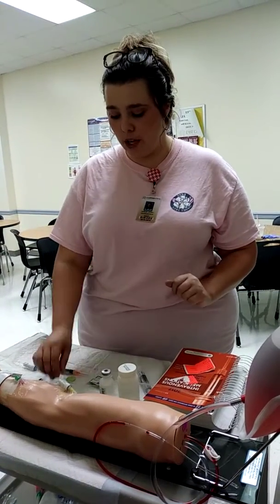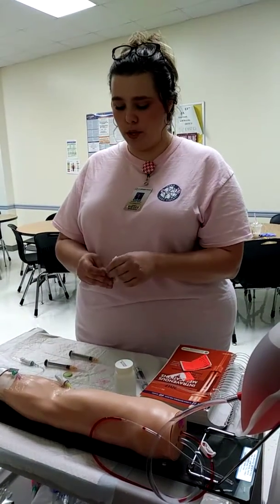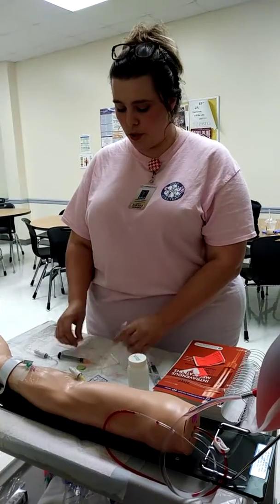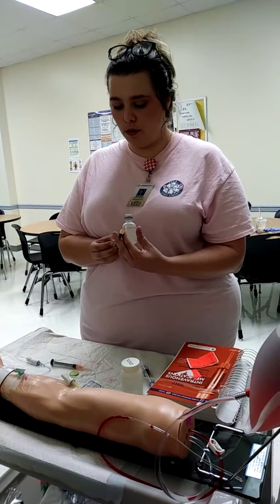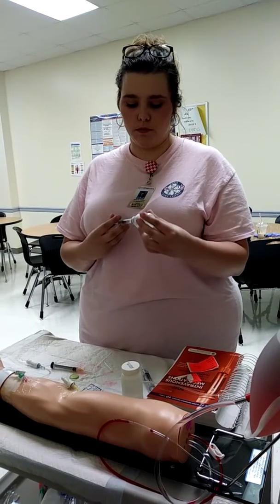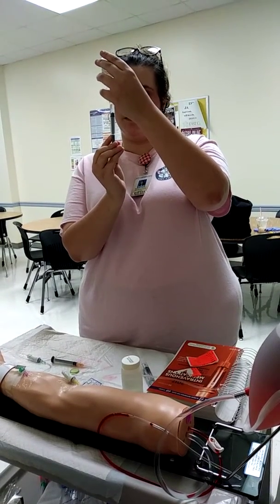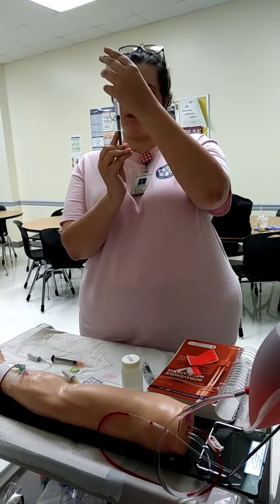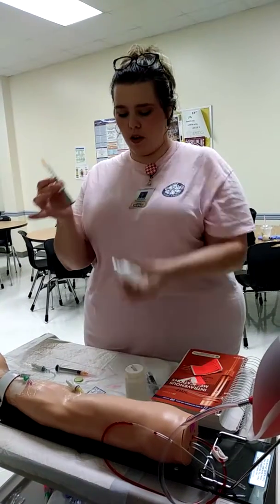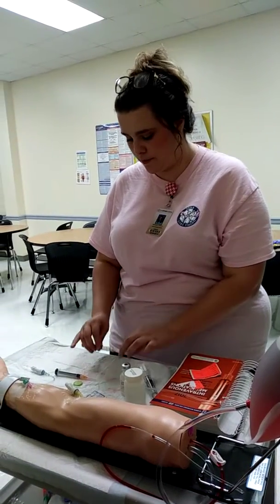Now, once I have all that done, I'm going to draw up the medication. I'm going to clean this really, really good. I'm going to draw up 2 mils. Withdraw the 2. 2 mils. Okay, we're good. All right, and then I'm going to scoop it, and I'm just going to tap it back in there.